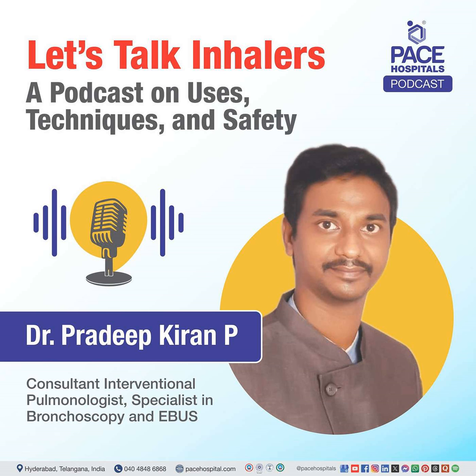Can you explain how to use different types of inhalers? I have already told you about the metered dose inhaler, MDI. So I am going to show you a sample of a metered dose inhaler. You are seeing this L-shaped one. This is called a metered dose inhaler. As you can see, there is a canister. This is the device. This is the mouthpiece. This is the cap. Similarly, this is an example of a spacer device which you can use along with the metered dose inhaler. There are various types of spacers. You can use any spacer, but the technique is the same with each and every spacer.